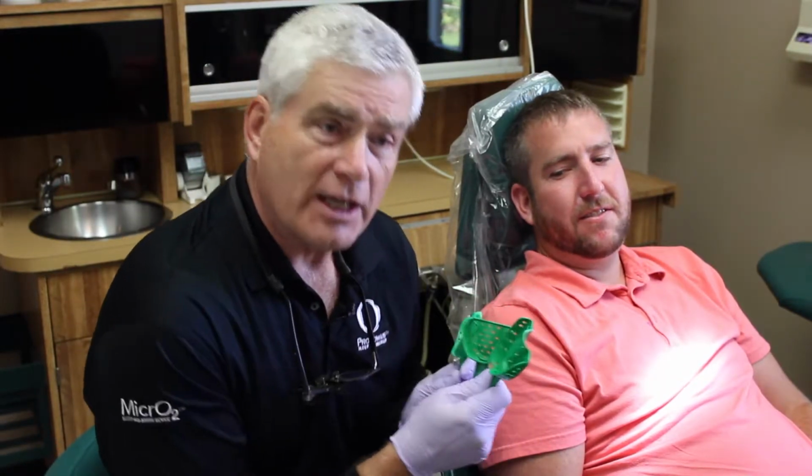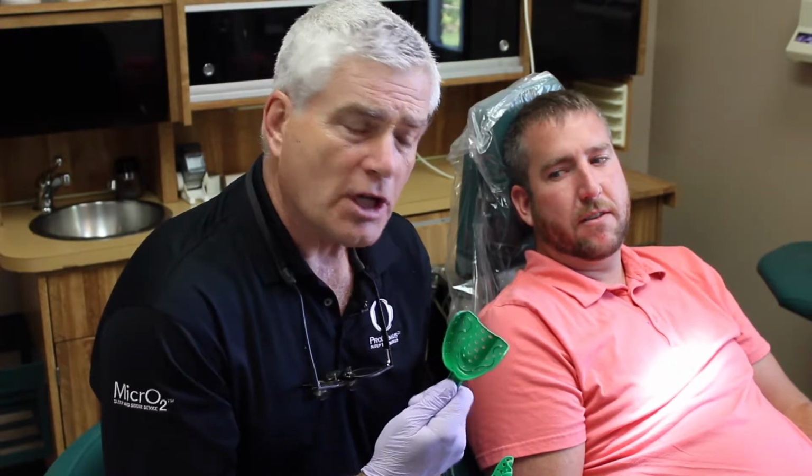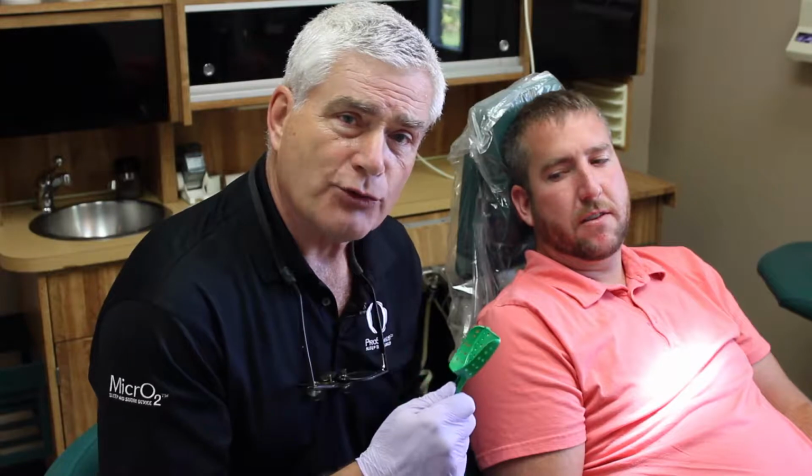There are so many different components to deciding how to take the best impression. Now Jeff and I make for an interesting comparable when selecting trays. For example, we're both about 6'3", and both an incredibly well-built physique of about 230 pounds. And I've got 3 different size trays here. Interestingly though, I'm a large, and generally with this large you might even soften these exterior flanges for me and bend them out just a little bit.